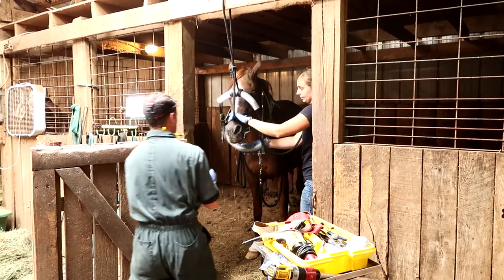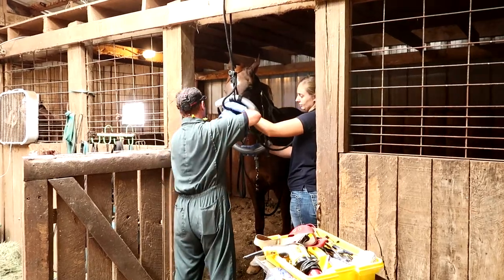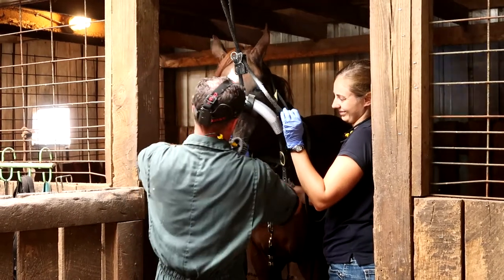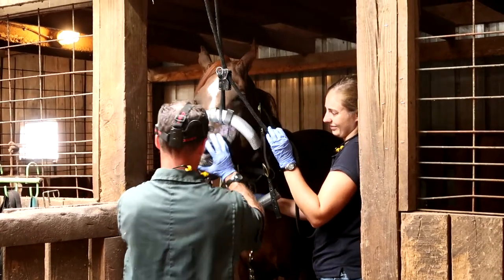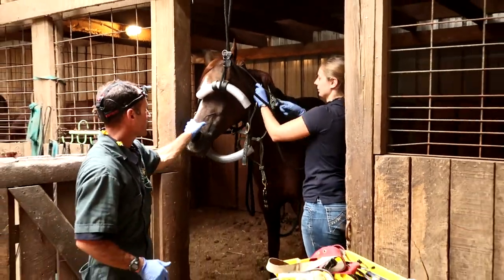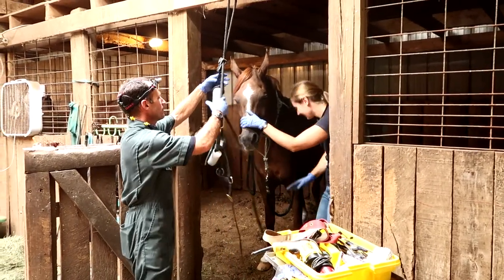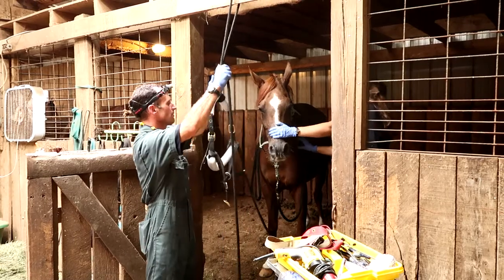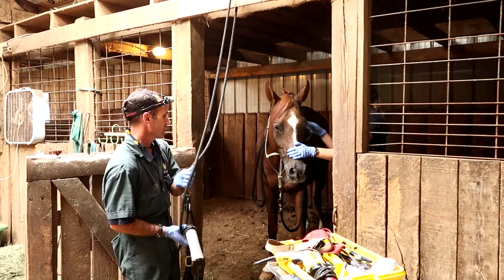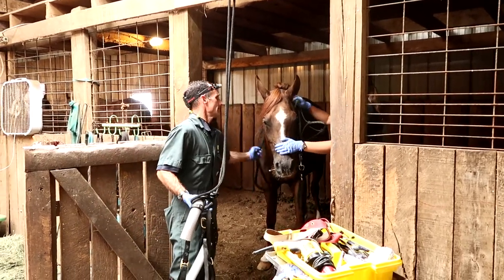I'd like to thank Dr. Scott and Ellen for being such good sports about letting me video this procedure. I know it's not easy doing something with a camera in your face, but I appreciate being able to share this educational opportunity. So he floated up really nicely — removed those rough cheek teeth edges that we identified earlier, and he did really well for that. This was our first interaction with this horse today and we want to make it a good experience for him, and he did just well.